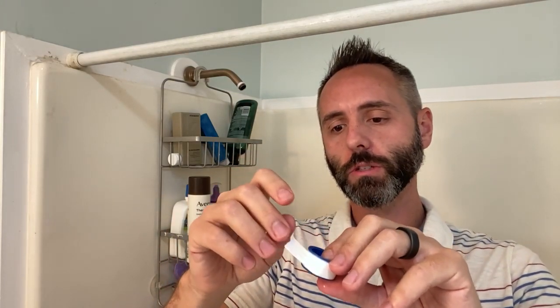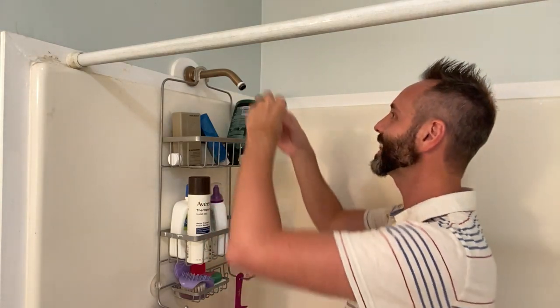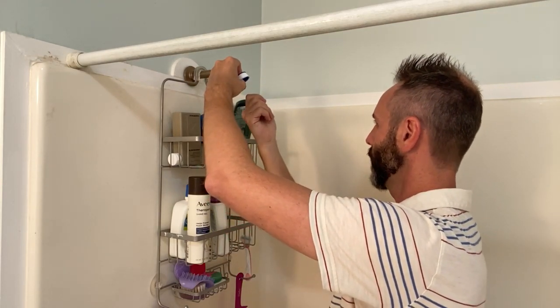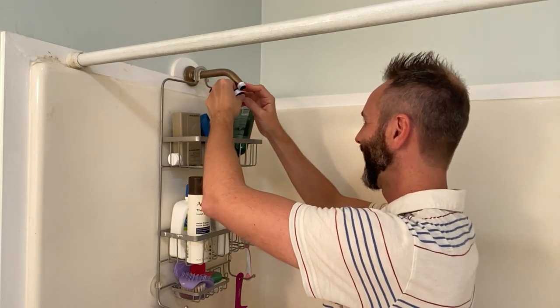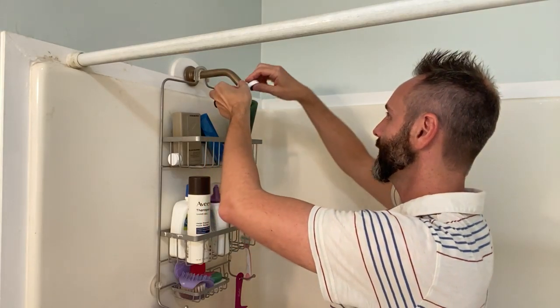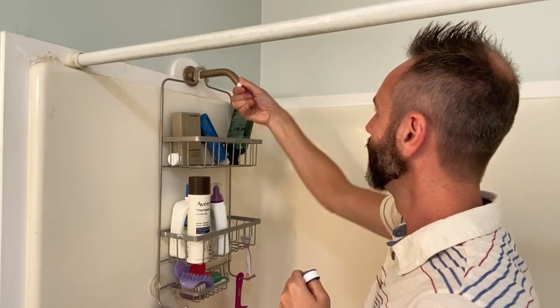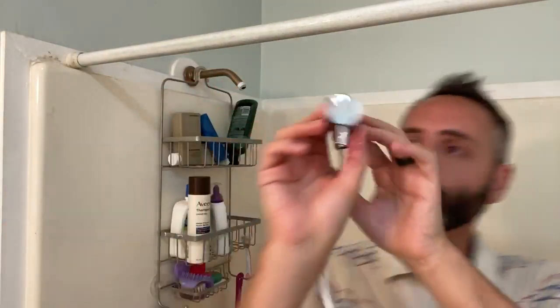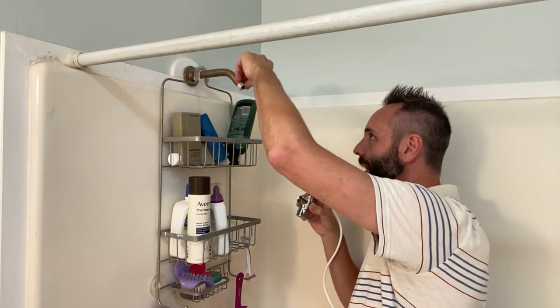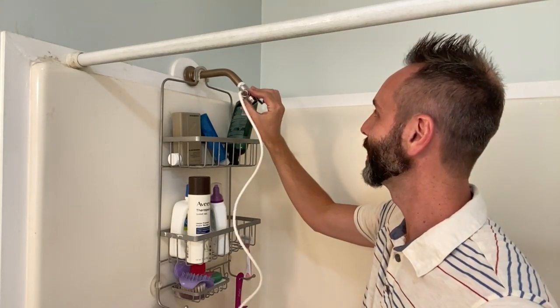For teflon tape: if you're turning it to the right to tighten — righty tighty — then you want to put the teflon tape the other way so it doesn't unravel as you're doing it. I like to press it into the threads to help it stay. Give it a couple of wraps around, maybe two or three, and just pull to tear it and press it down. You don't want it too thick or else you won't catch the threads well when you screw the other parts in.